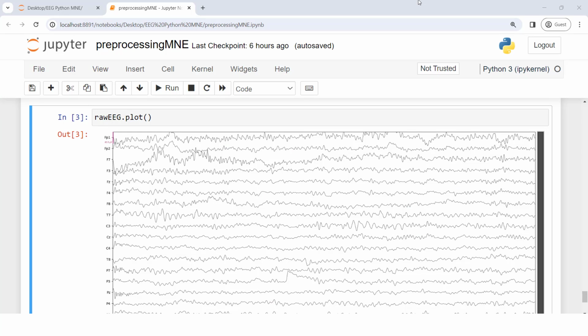Well, my friends, in the previous videos, we've covered essential steps in pre-processing our EEG data, including filtering and utilizing independent component analysis to eliminate various artifact patterns. However, despite our efforts, there might still be lingering artifacts that could impact the quality of data. In this video, I will teach you the process of manually removing any remaining artifacts through visual inspection.